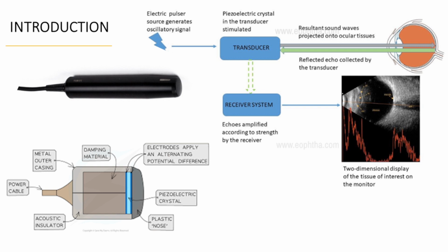The echo waves are produced in a pulsed manner, so it is called pulse echo. In between the two acoustic waveforms, the waves returning back are collected in the transducer. These waves are sent to the receiver system, which displays them on the monitor, and we see the scan as a 2D image of the ultrasound.